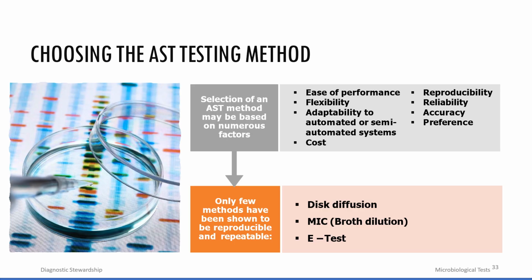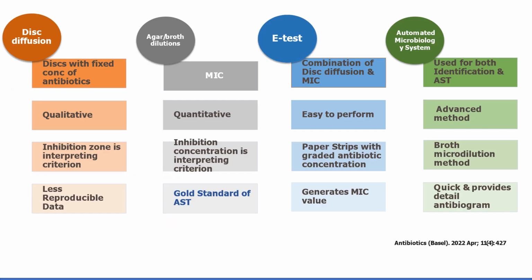Choosing the right testing method is essential, and it depends upon the performance, flexibility, adaptability, cost, reliability, reproducibility, accuracy, and performance preference. Only a few methods have been shown to be reproducible and repeatable. This includes disc diffusion, MIC testing, and E-test. And we have seen that there are different methods available now. Let us see the unique features of these tests.